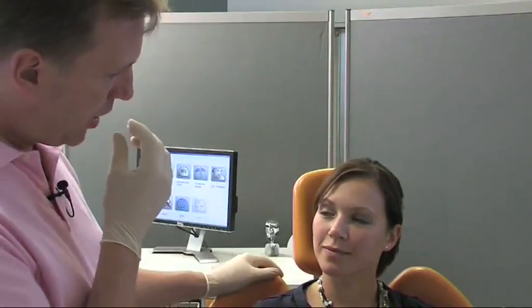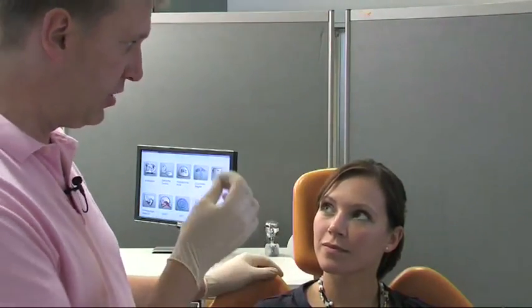We now have to find out what is causing this pain. It could be the way you bite. Just biting your teeth together we call static occlusion, or biting with movement, which we call dynamic occlusion. Or it could be caused by grinding your teeth together, or other factors such as swallowing patterns. We know that you have pain, and we want to find out if this is being caused by your static occlusion or the dynamic occlusion, or by grinding your teeth. We will do this by an electronic analysis.